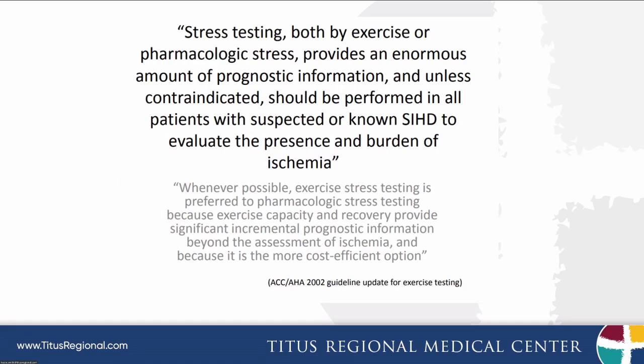Stress testing in general is better if we can have a patient exercise because it gives us a lot more information. But as we'll see as we go through the presentation today, some patients just aren't going to be able to do that. And we can still gain a lot of information from a non-stress or a pharmacologic stress test as well.